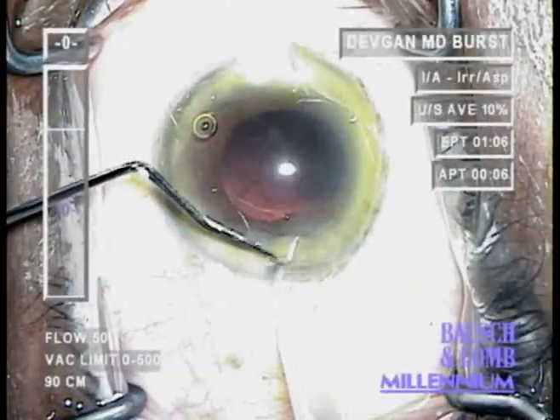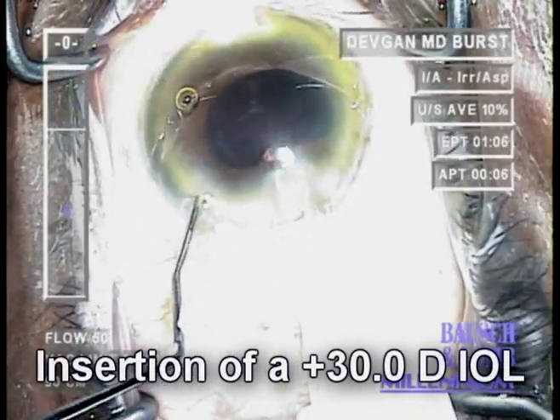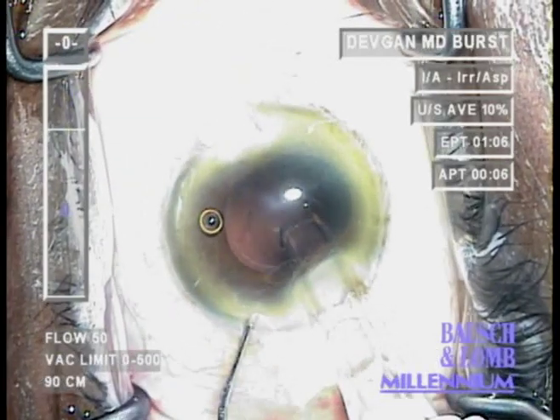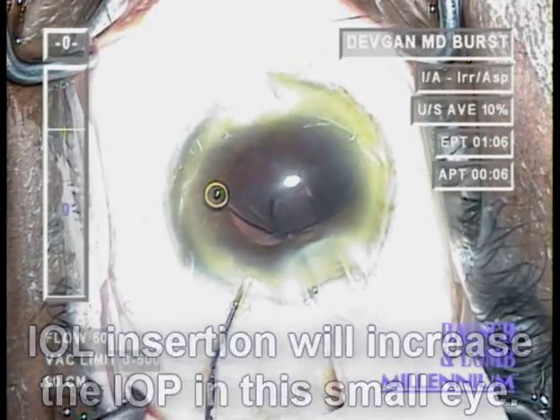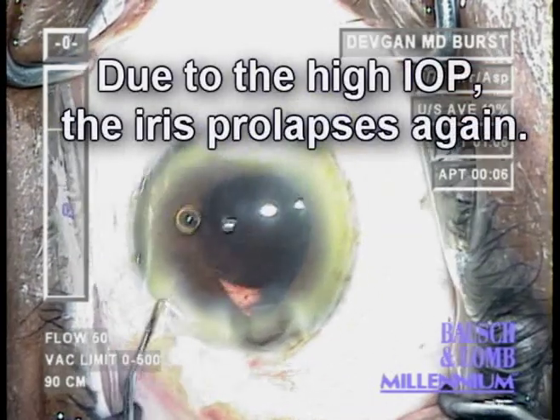Now with lens insertion, we're going to insert a large lens — 30 diopters. As we insert the IOL, we insert some viscoelastic in the eye. This insertion of the lens and viscoelastic will cause a pressure increase. And what will happen when the pressure increases? The iris will prolapse. There it is again.